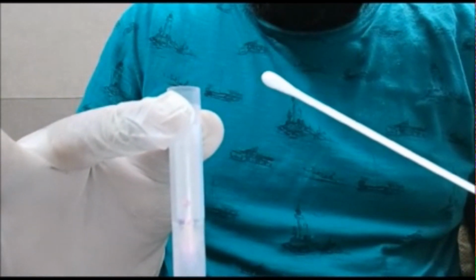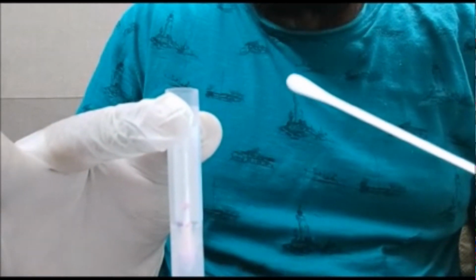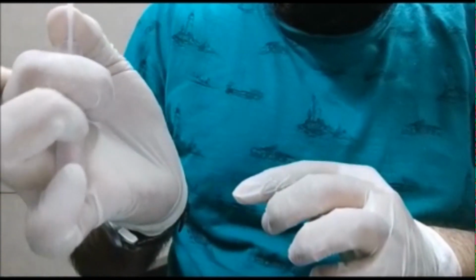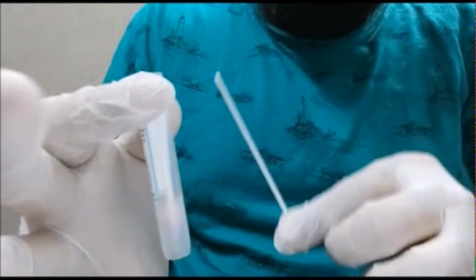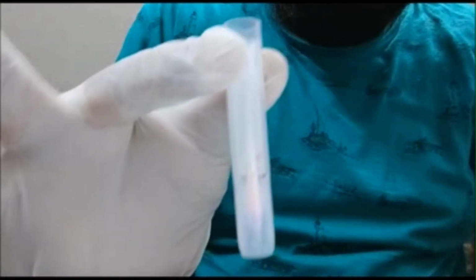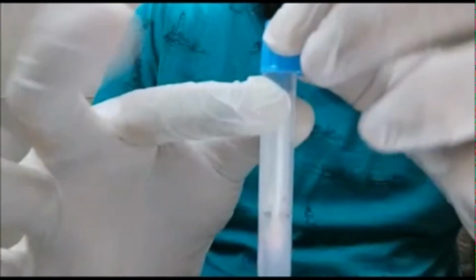Considering this also has collected the specimen from the nasal throat, I'm placing it over here like this, bending it using my index finger, it simply breaks. Now it has 2 swabs within this. We're just closing it up like this.